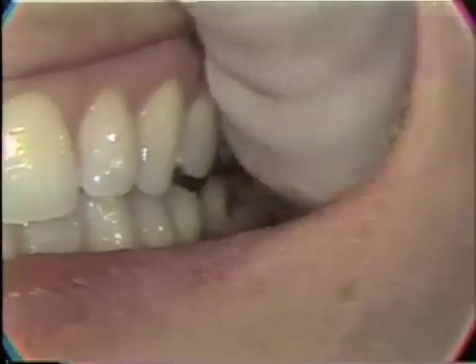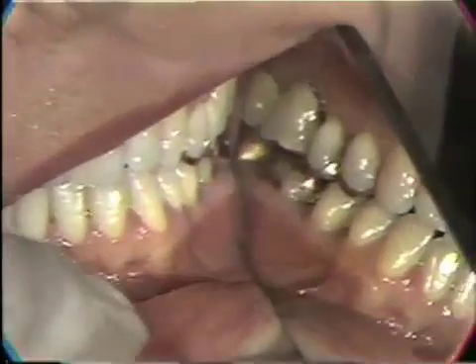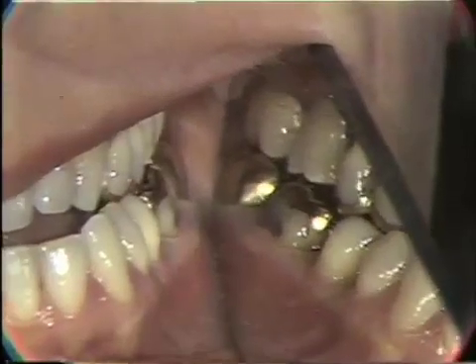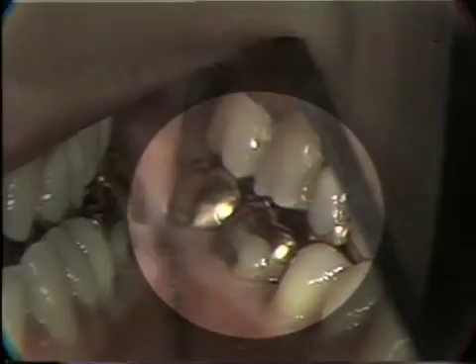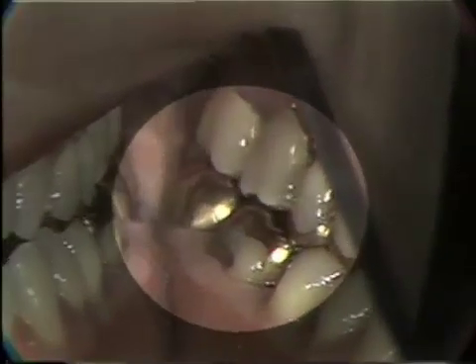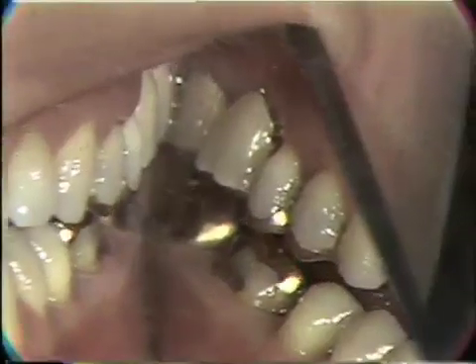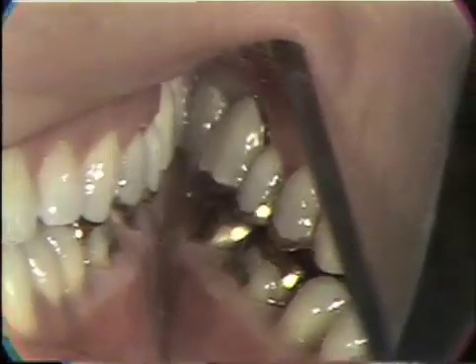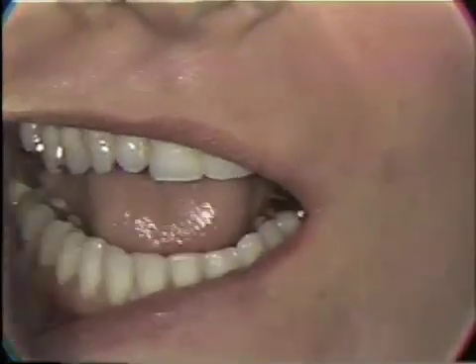The patient is directed to close the back teeth together, then move to the right and left with teeth together. You can see the tripping on the working side. She has interferences on the working side as well as the balancing side.